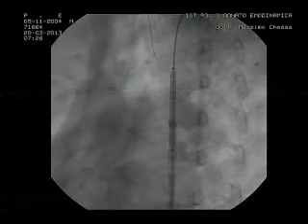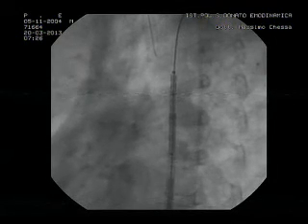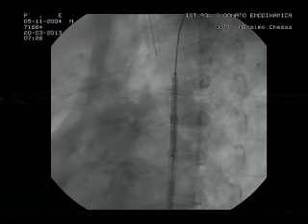So what? Yeah, you agree, Massimo? Yes, yeah, you know that. You have a good reference point there, which is the endotracheal tube. I think the stent will be placed rather there. I think this is the position of the stent.